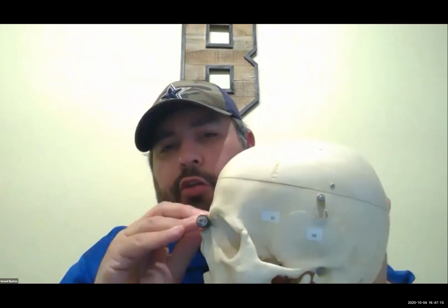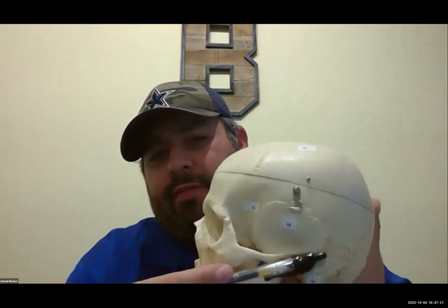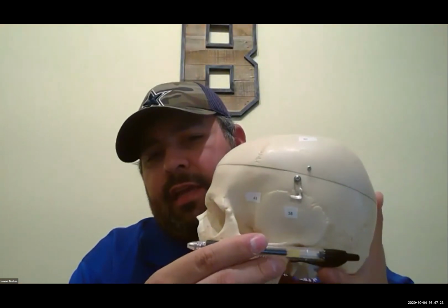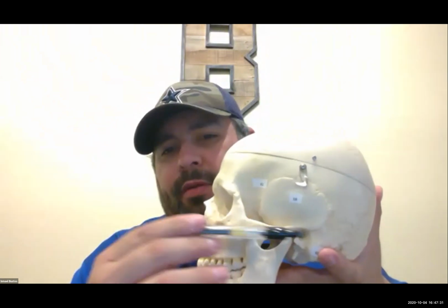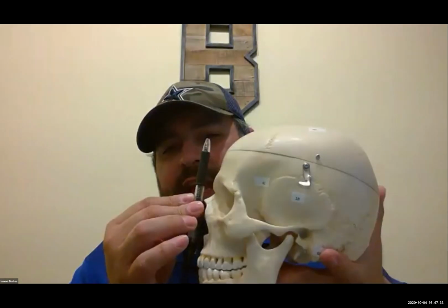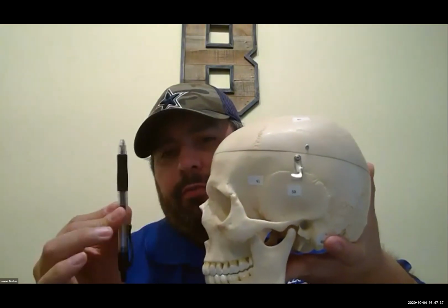We also want to make sure the mid-sagittal plane, which is the plane that comes down the body, is parallel to the front edge of the image receptor. Then you also want to have the IOML, which is that line there, perpendicular to the front edge of the image receptor. My image receptor front edge was here, so you want this IOML to be perpendicular to it. Then you want the GAL to be parallel to the front edge of the image receptor.